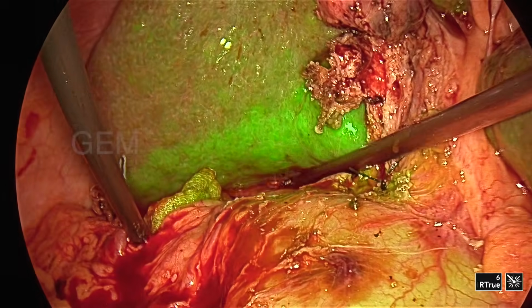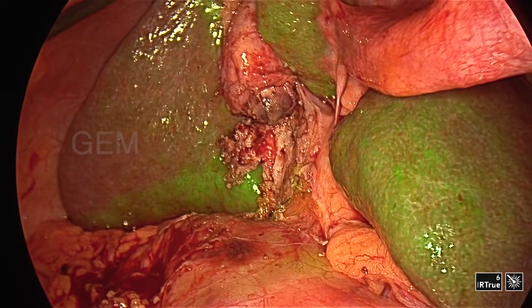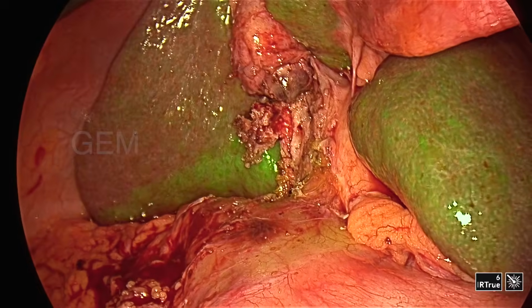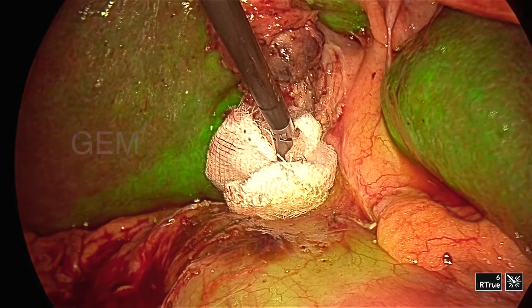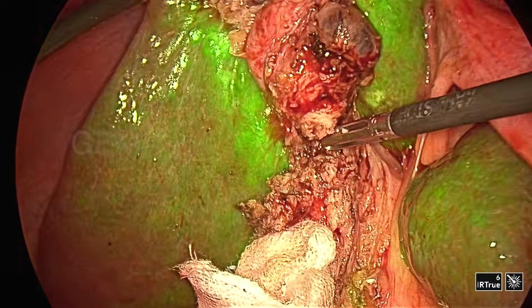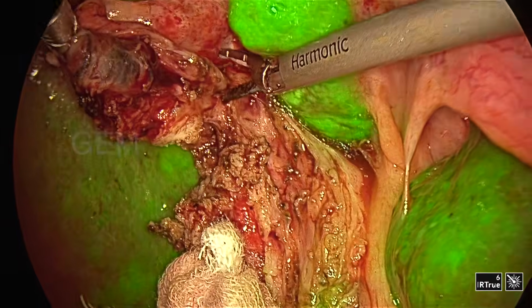You can see the gauze piece, no green color, that means it is not a bile stained gauze piece. So I have to remove the gauze piece, I have to keep a fresh gauze piece. See, fresh gauze piece, I am keeping it in that area. Then I started mobilizing, started excising the gallbladder. Again you can see the CBD is very clear, very well demonstrated here.